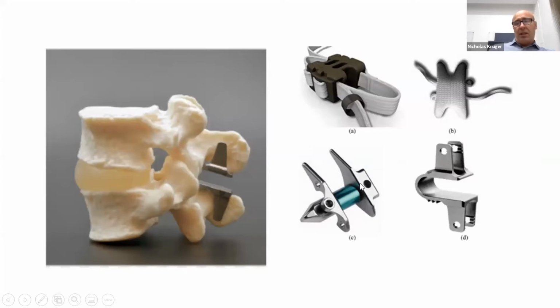They're easy to put in, percutaneously from the side. It does cause local kyphosis and unbuckles the flavum from there. It's okay, but they don't last terribly long. The spinous process is not really designed as a weight bearing device, and then you lose height again.